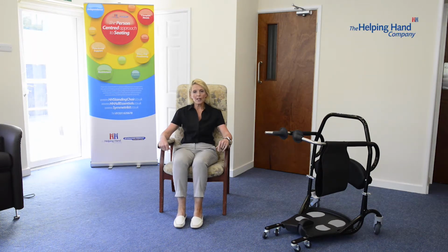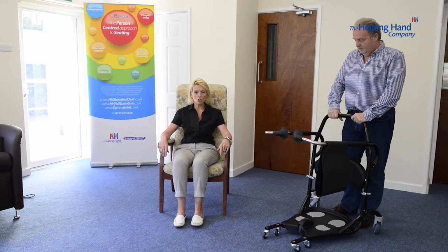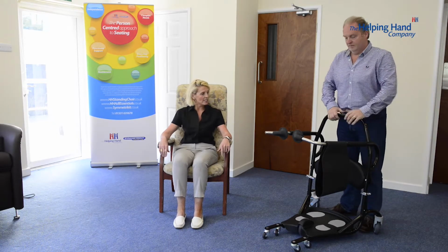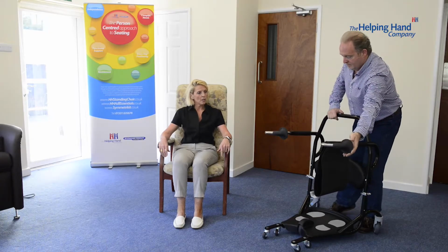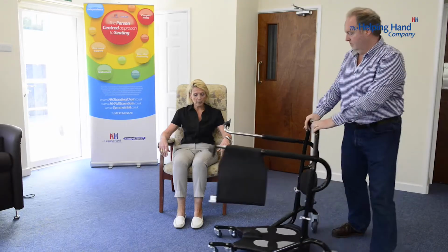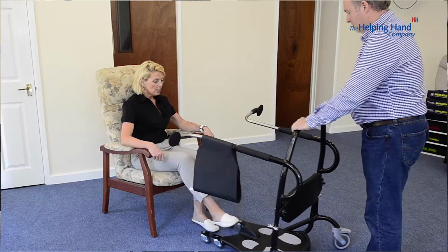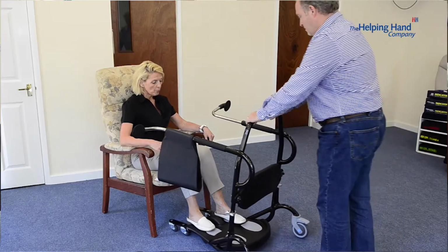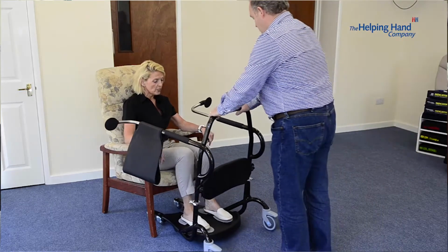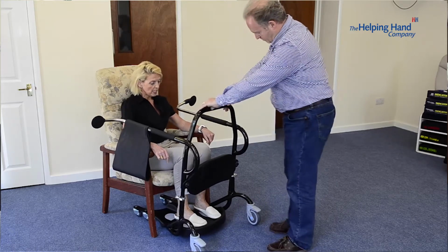So we're just going to show now how easy it is to do the transfer from a seated position onto the cricket. My trusted assistant Richard is with me. So bringing the cricket round, and as it comes up, obviously making sure that we can get between the legs of the chair and gradually encouraging your client to put their feet onto the footprints, and bringing the cricket in close but not too close to the knees.